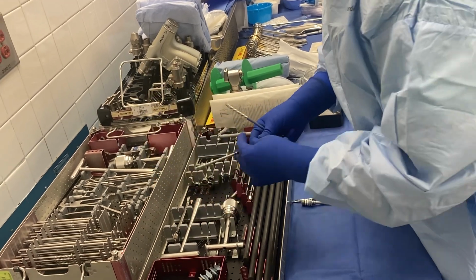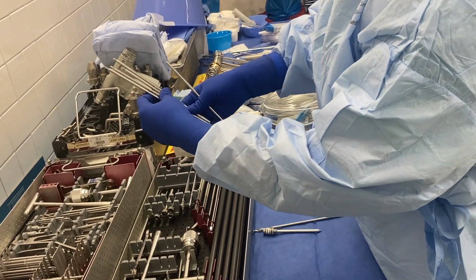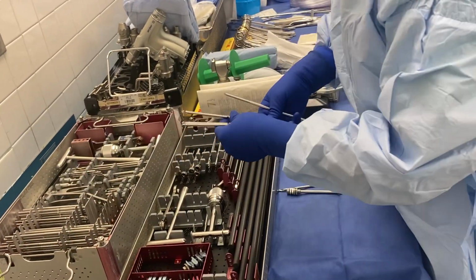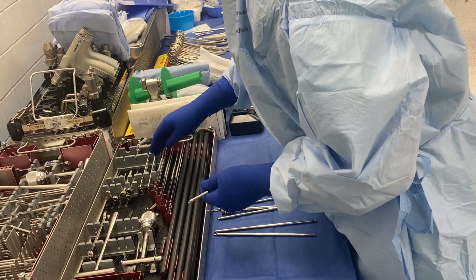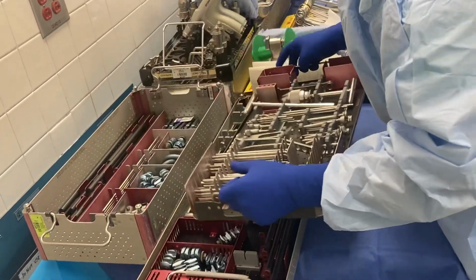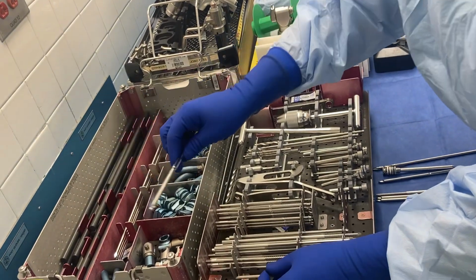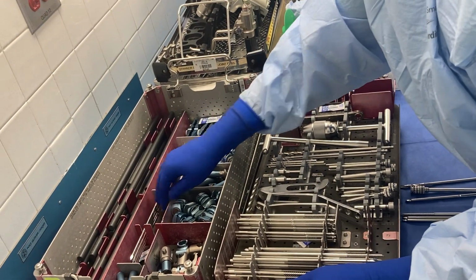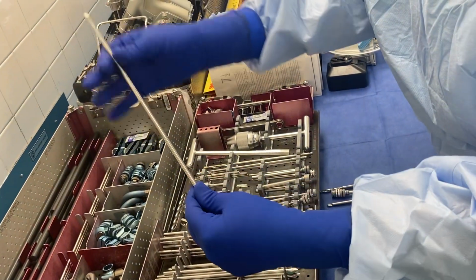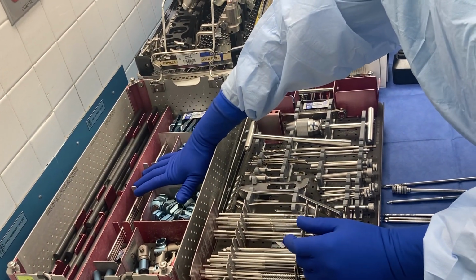So I would pull out at least 4 of these. They're different lengths, so you want to make sure you get them all the same length. So this one's too short. They'll even have some in the bottom if we need more. I think there's some in here as well. So I'll have to find another one, but at the minimum we would need 4. We have 6.0 pins as well. Those are really big. We usually put those in the pelvis, so we should not need those today. If they go into the calcaneus, we have calcaneus pins, and they have threads in the middle of the pin here. I do not know if we're going into the calcaneus, so I'm not going to get that out just yet.